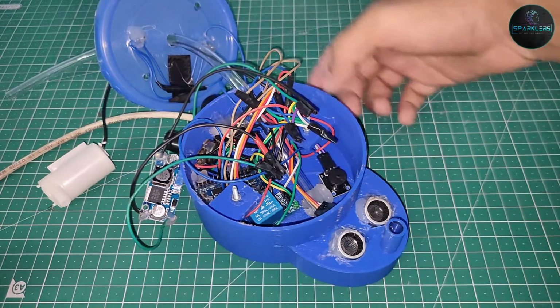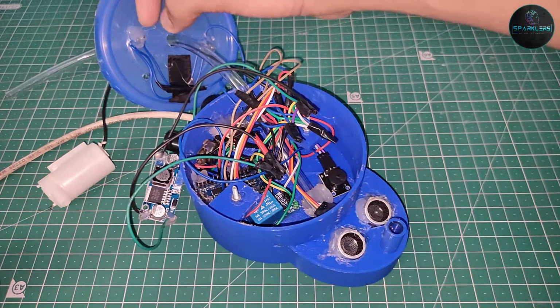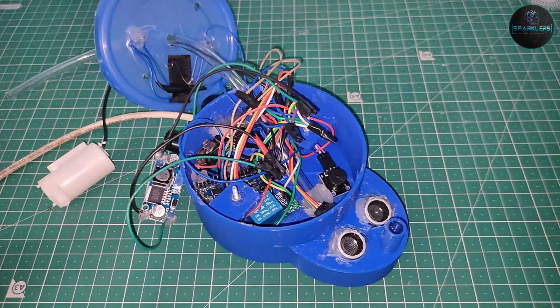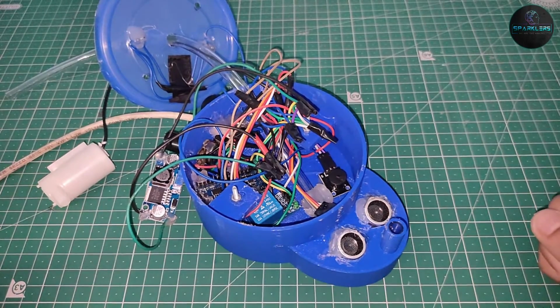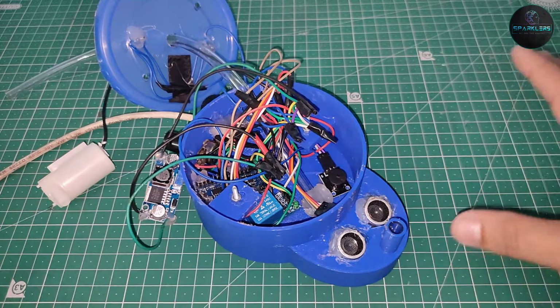Also at the same time it is going to beep using this buzzer, and also it is going to glow this LED. Okay, and using these 2 potentiometers we can control the distance and the amount of time for which the sanitizer will come out. Okay, so this is how everything will work.